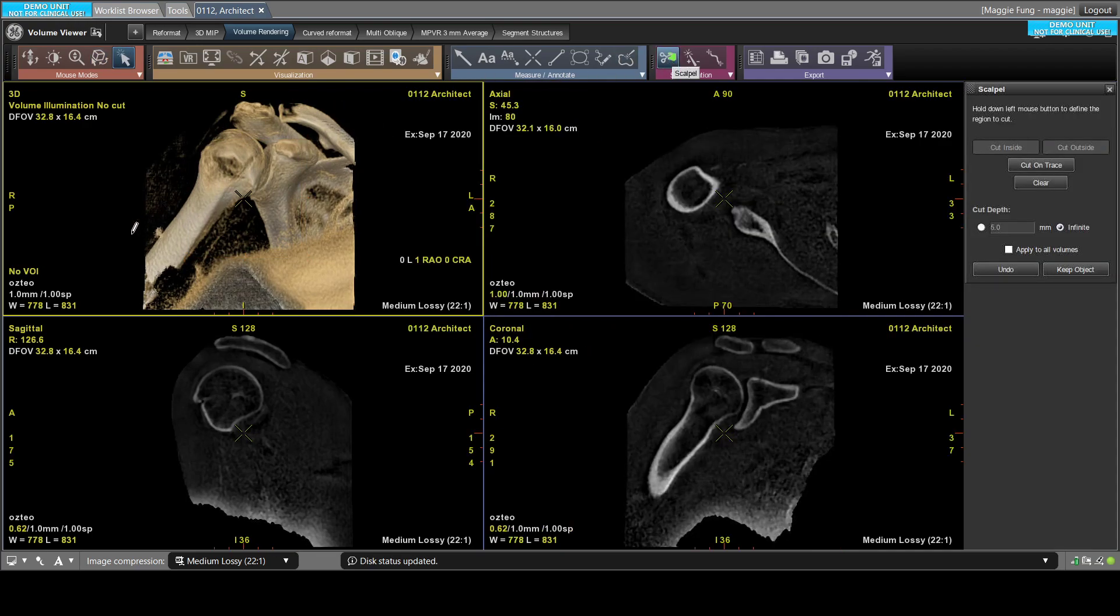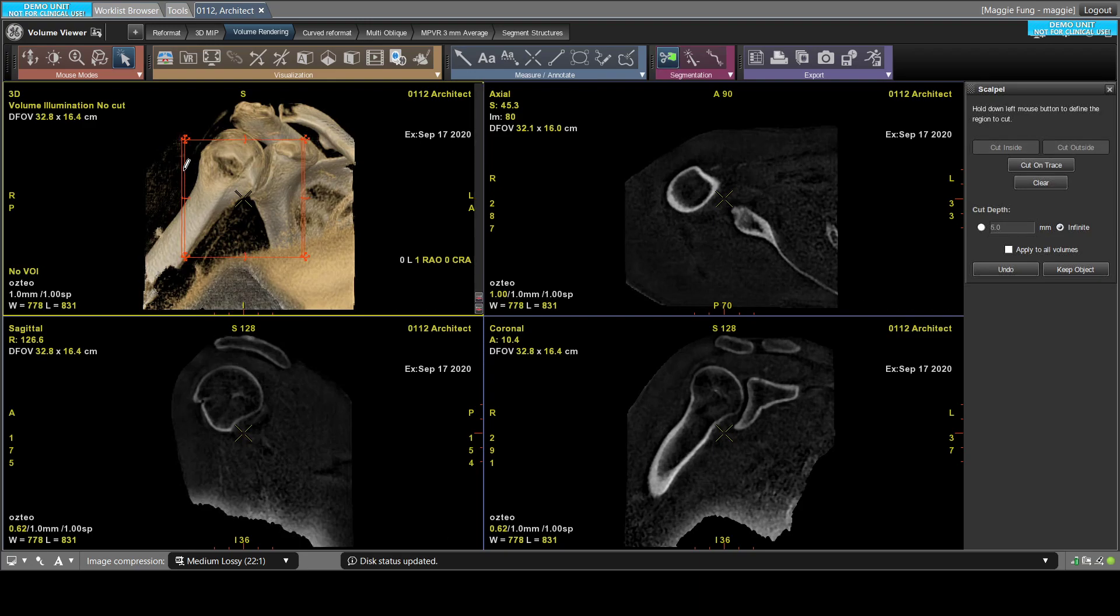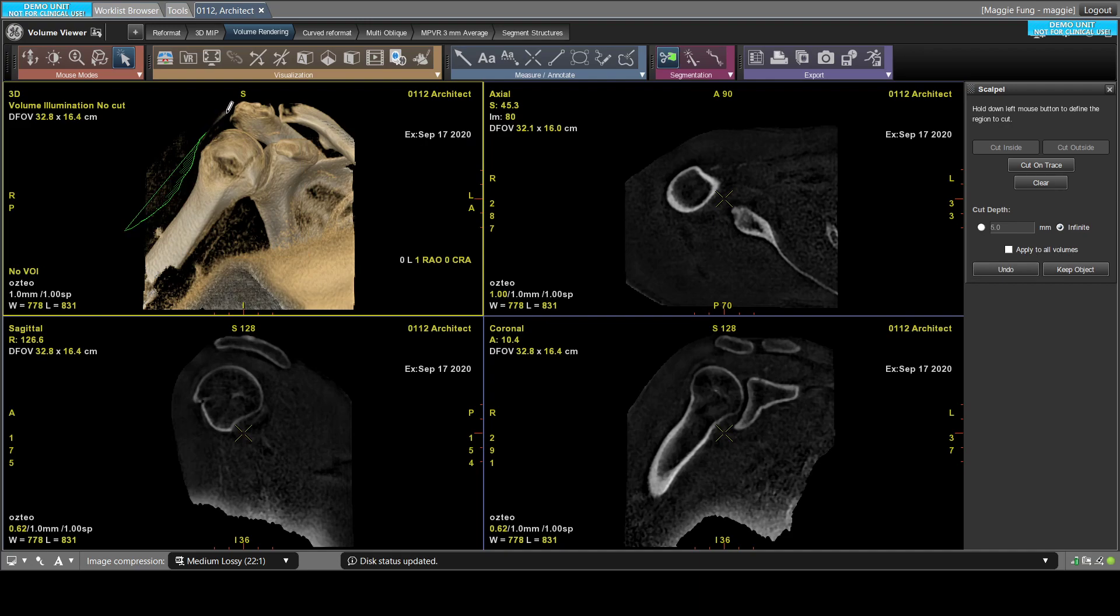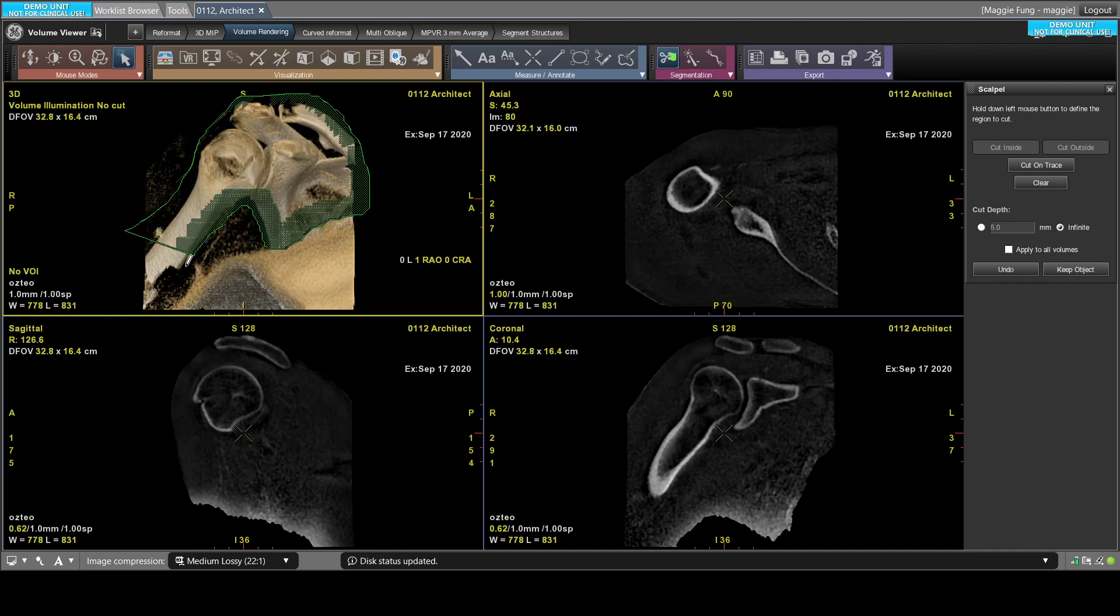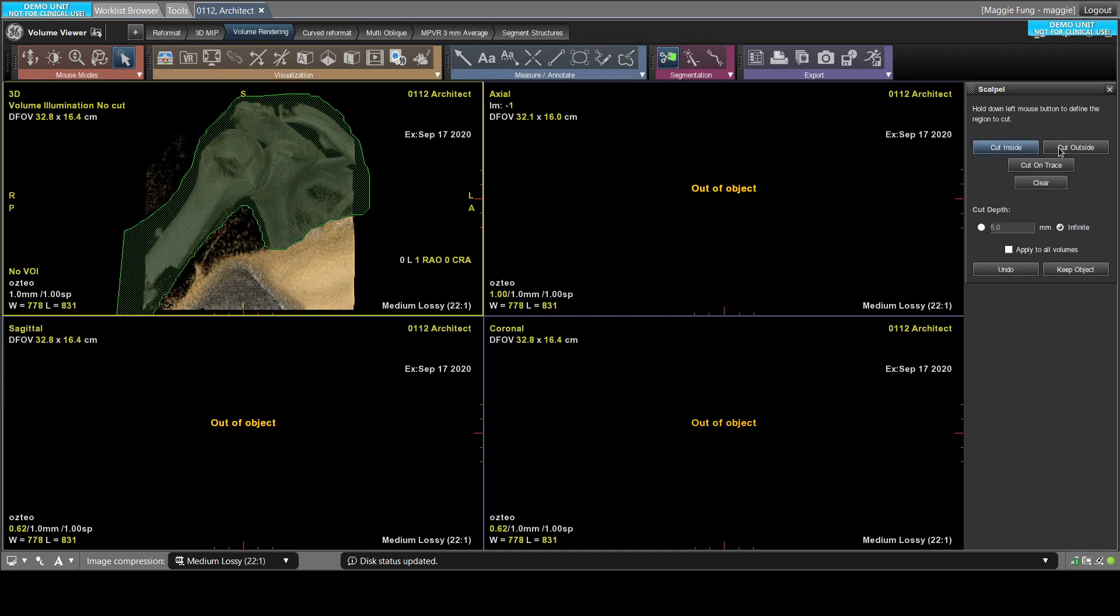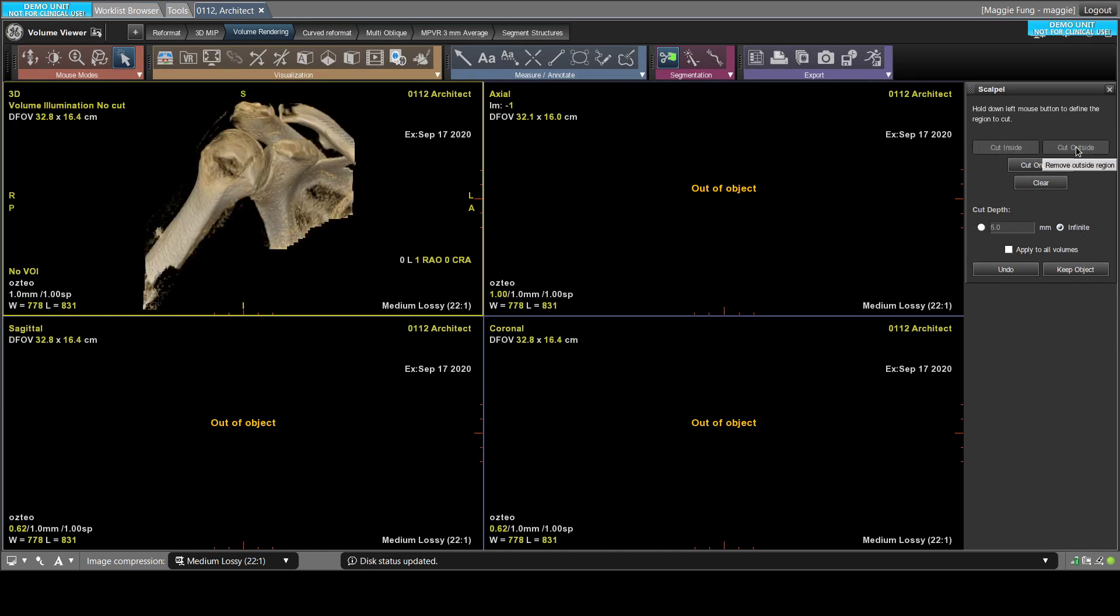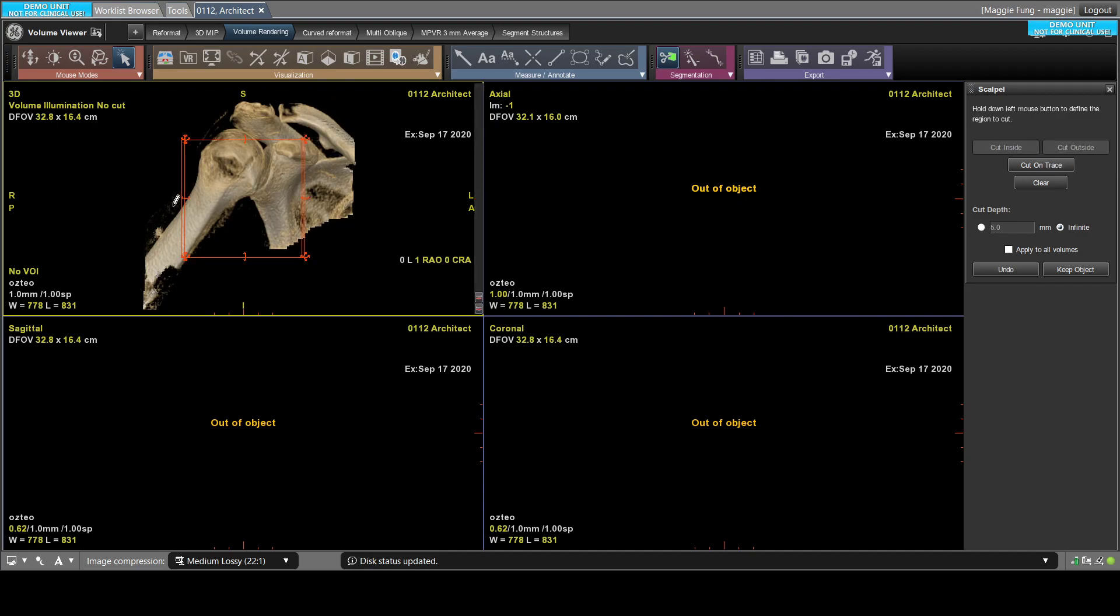Once you click on the scalpel tool, you'll highlight everything that you don't want, say we can do something like this, and then say cut outside. Now we've got a pretty clean view.